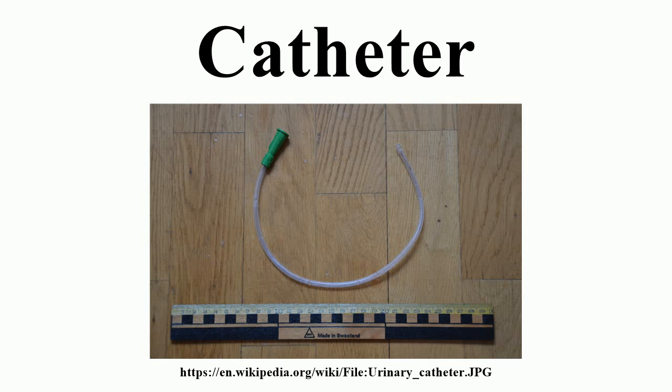Catheters can be inserted into a body cavity, duct, or vessel. Functionally, they allow drainage, administration of fluids or gases, access by surgical instruments, and also perform a wide variety of other tasks depending on the type of catheter. The process of inserting a catheter is catheterization.